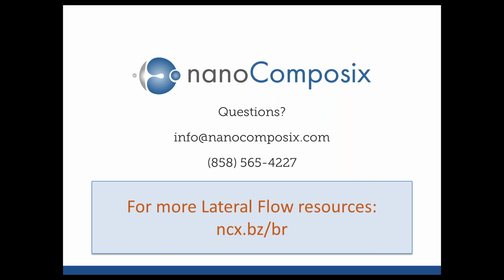Great, thank you, Jean. Our next question comes from Zoe. Is a competitive format better to detect lower concentrations of antigen than a sandwich assay format? Not necessarily. It really depends what type of antigen you're looking for. Competitive formats are used when the antigen is usually really small, such as drugs of abuse or small steroid hormones, because the analyte itself can't bind to antibodies simultaneously. So it's not necessarily a sensitivity issue. It really depends on your analyte size and how many epitopes are available.